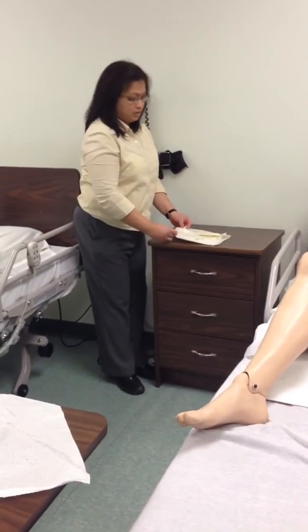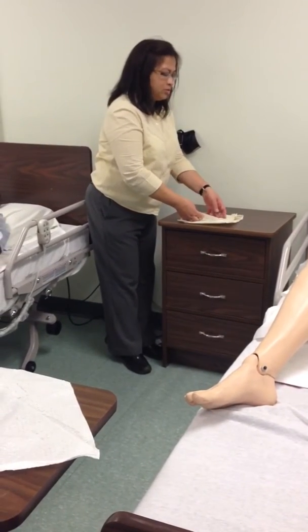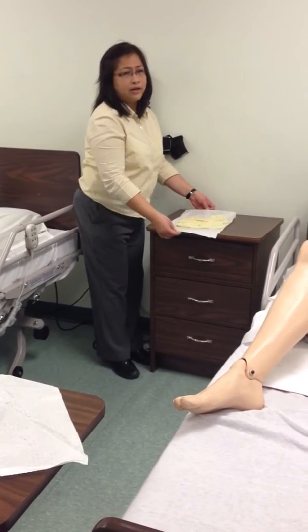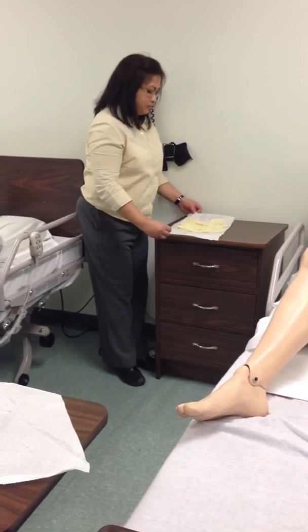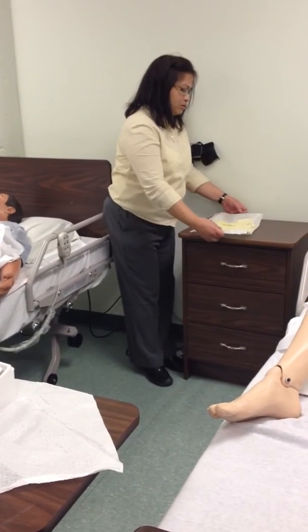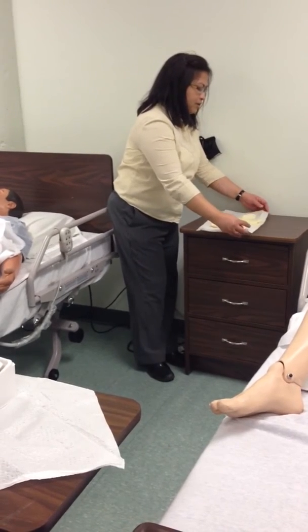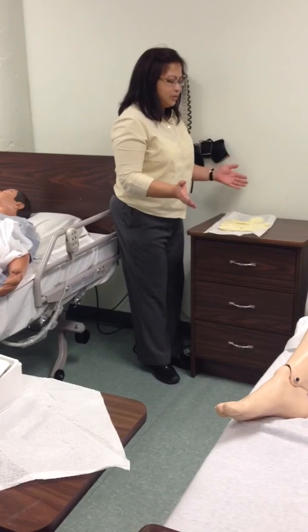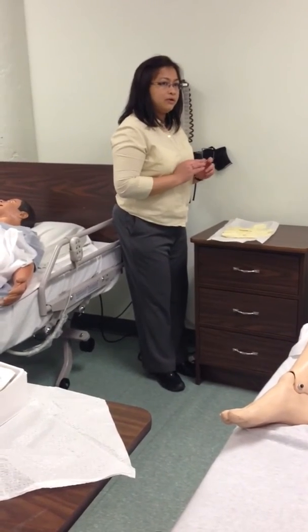Put it properly. Do we need to know our sizes? Of course, you need to know your sizes. I think yours is probably 8 or 8.5. I tried 8.5 in the room and I couldn't put it on. Really? My hands are too wide. 9. All right, we'll go with 9. Okay. You need to make sure that the flap is not going to fold back, right? Because technically it's contaminated if it folds back.